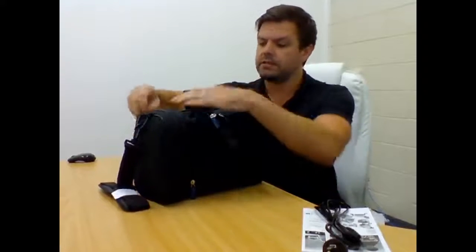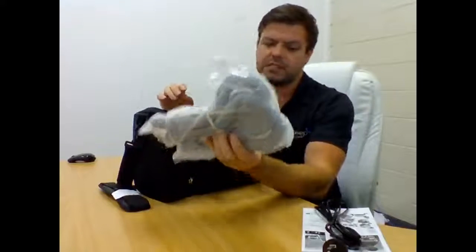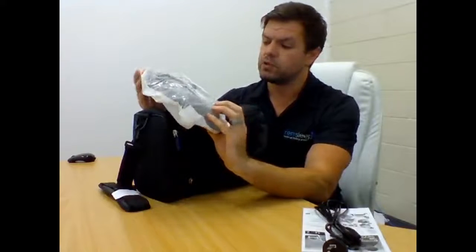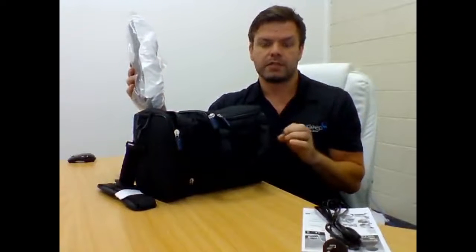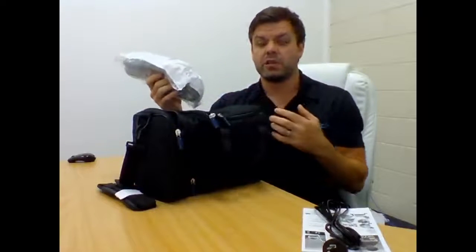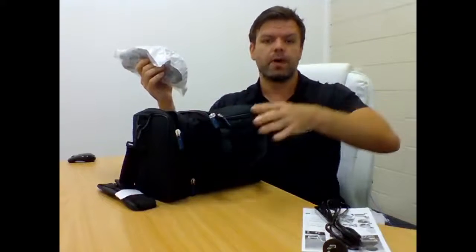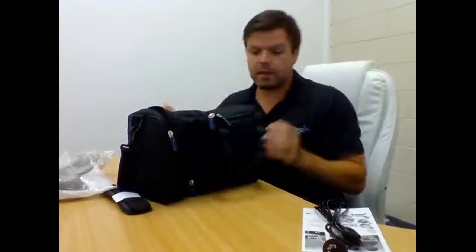In this section at the front here, if we reach in there, we will have our CPAP tubing. That's your standard CPAP tubing that it comes with. It's 22 mil CPAP tubing. For those of you that don't know, all CPAP tube ends are universal, which means that every CPAP machine tubing will fit every mask. All CPAP masks are made 22 mil, and the ends of the CPAP tubing are also 22 mil, and that means you can use a Philips mask with a Fisher & Paykel machine and so on. That's one of the really good things that the CPAP industry has done. It just makes my life a whole lot easier.